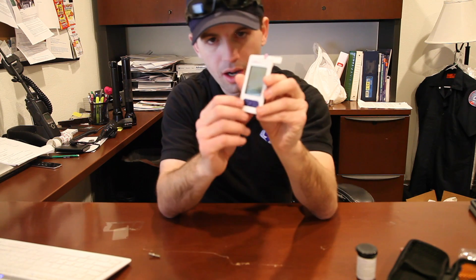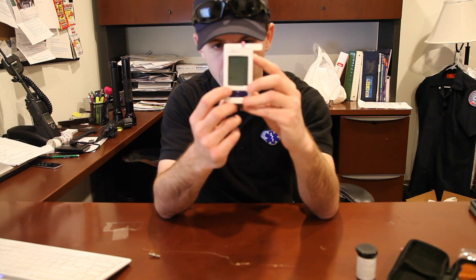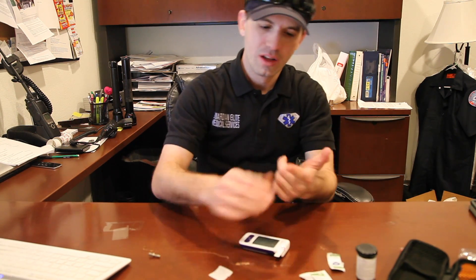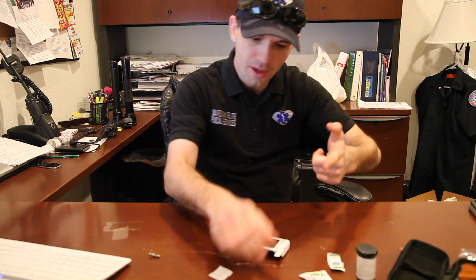Once you get the little icon showing that the strip is ready to accept blood — there's a little blood icon — then you'll go ahead and prep the patient. Take your alcohol prep, clean their finger. We want to go ahead and milk the finger, make it nice and red, to get some blood in the finger.